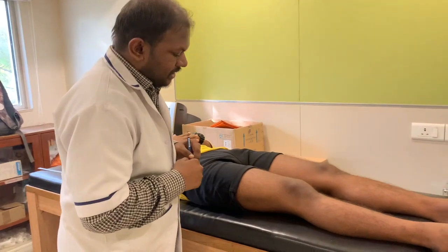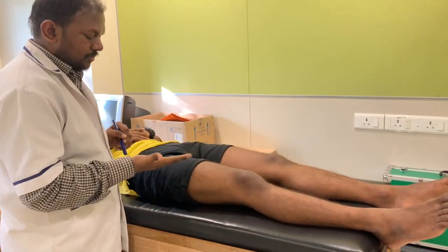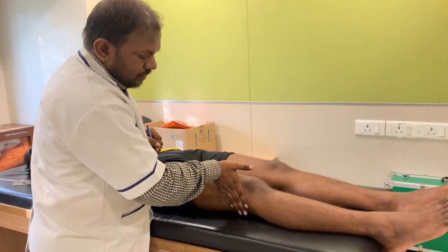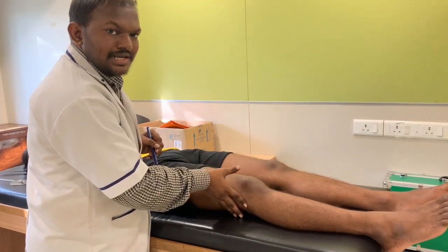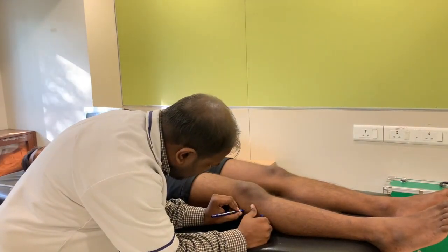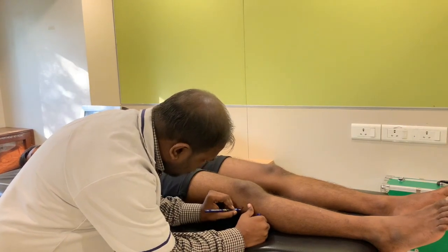Now, to palpate the lateral epicondyle of the femur, you have to keep your palm on the lateral aspect of the thigh and slide down below. Now here I can feel a first bony prominence which is called the lateral epicondyle of the femur. So here with a marker I will mark a point to keep a goniometer.